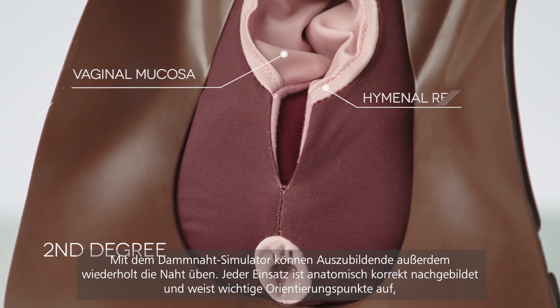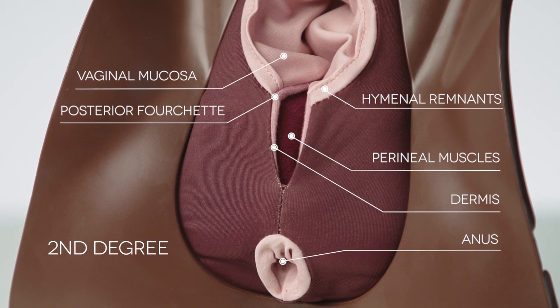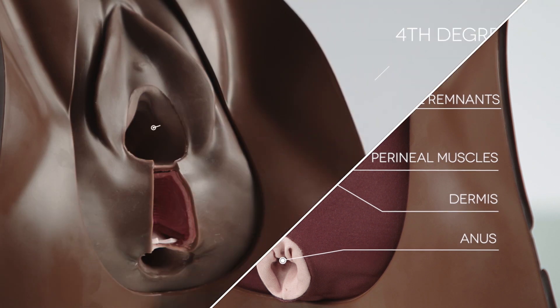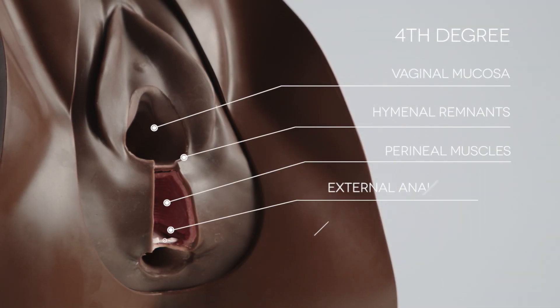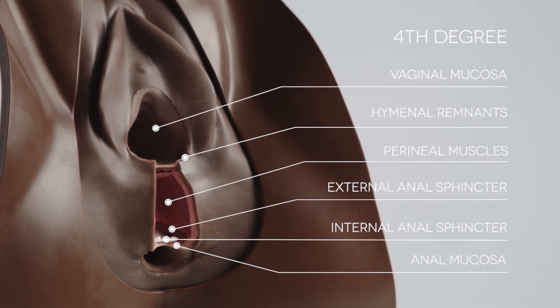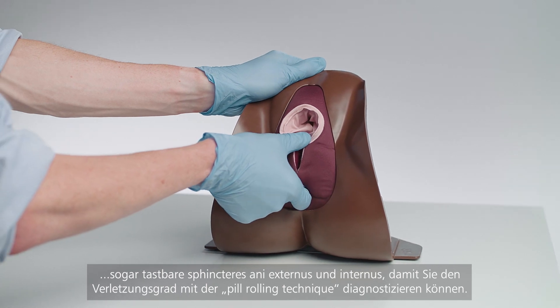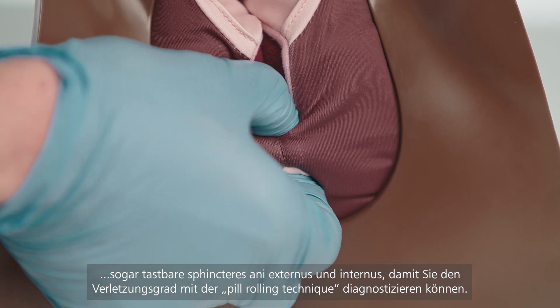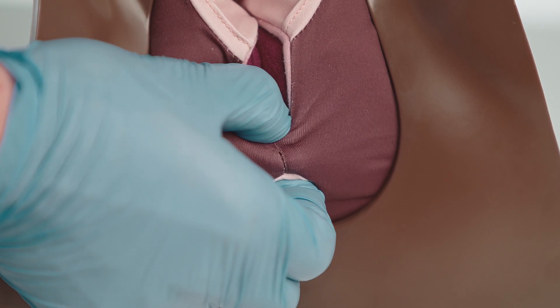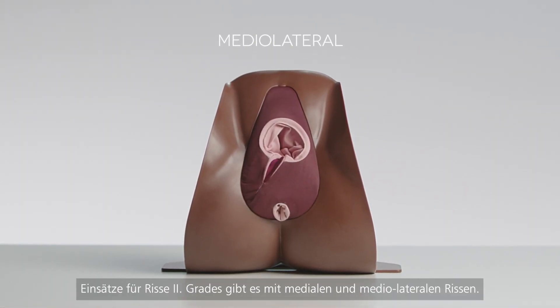Anatomically accurate, each pad features essential landmarks and palpable anal sphincters for classification of the injury via the pill-rolling technique. The second-degree pads are available in midline and medial-lateral variants.